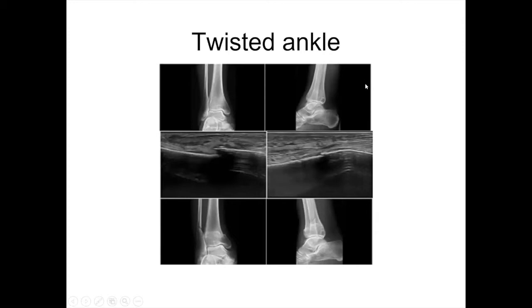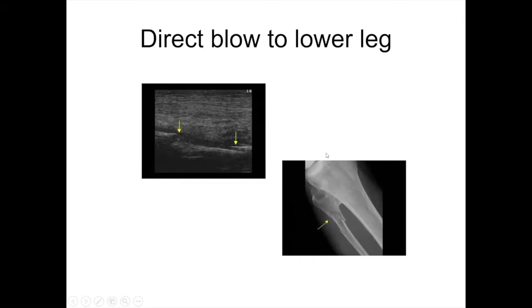Here we have a twisted ankle. At the top we have what looks like a normal ankle x-ray. An ultrasound showed cortical disruption and some fluid, making it clear this was a non-displaced fracture through the fibula and tibia. This shows how much more sensitive ultrasound is than x-ray, particularly for non-displaced fractures.